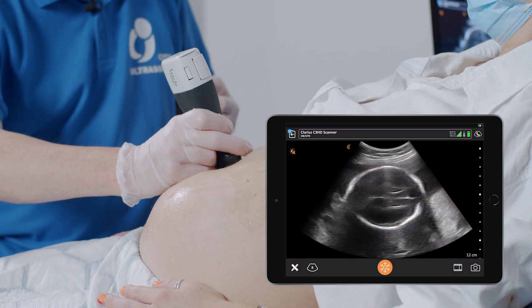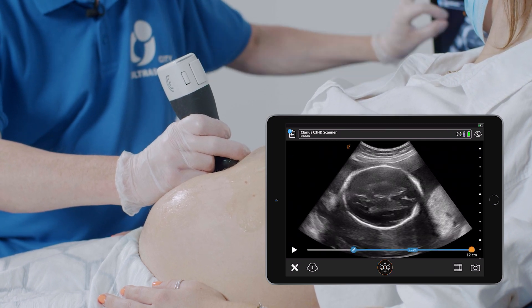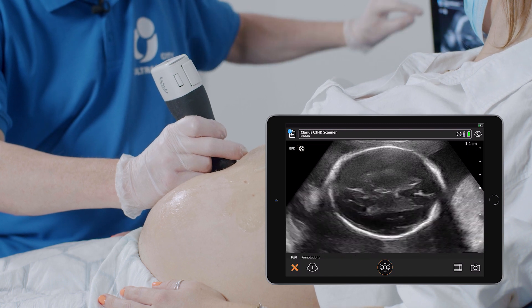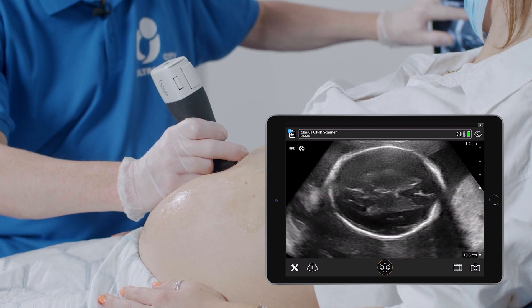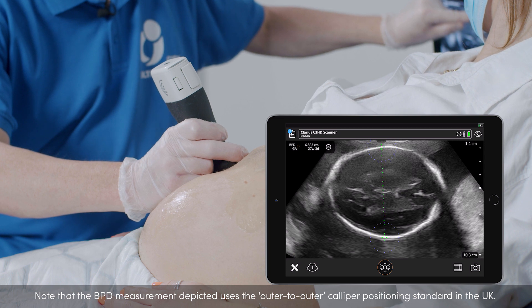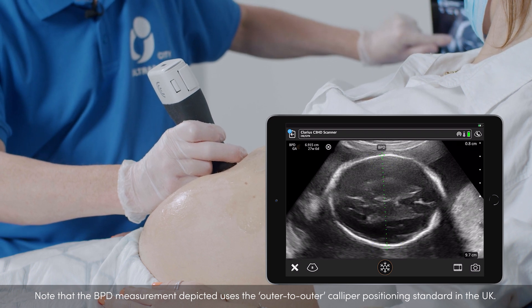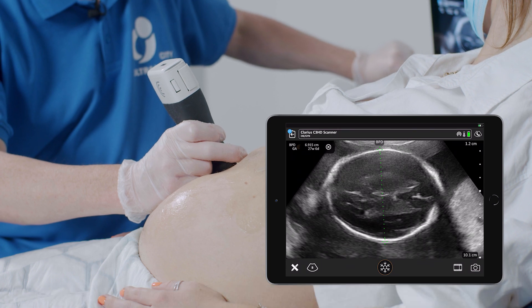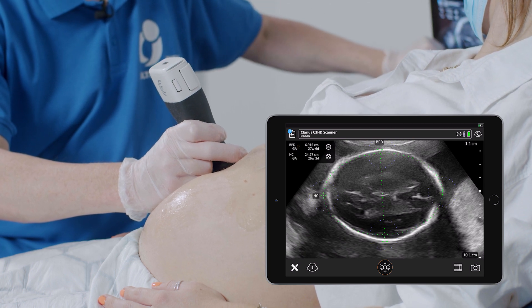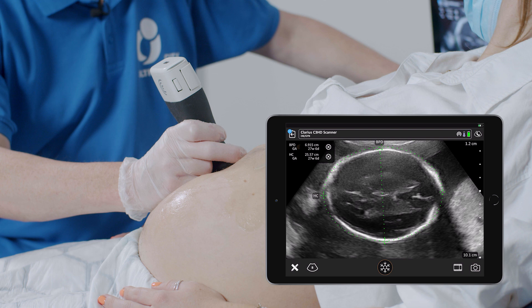So in this case I will start from measurement of the head. I'm getting the image of the head, enlarging it, and doing the correct measurement of the BPD. We are using UK out-to-out measurement, so we are measuring from the outer part of the parietal bone to the outer part of the parietal bone. I'm also measuring the head circumference, adjusting the position of the calipers.